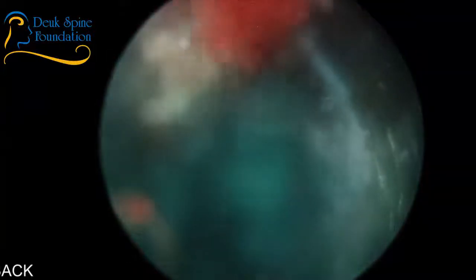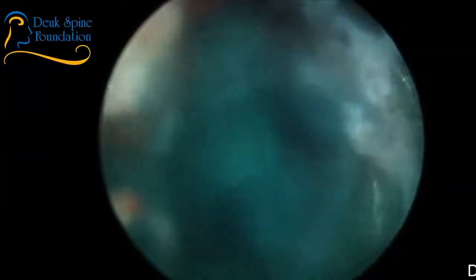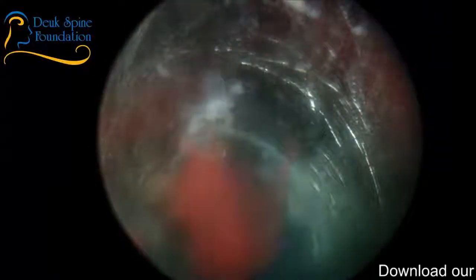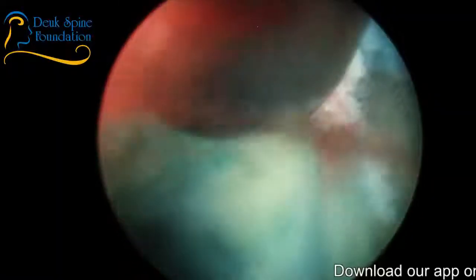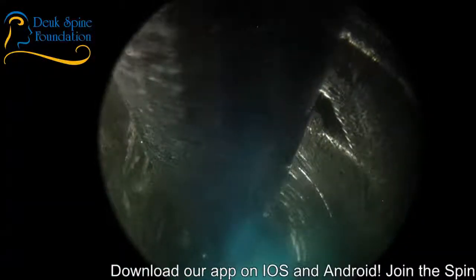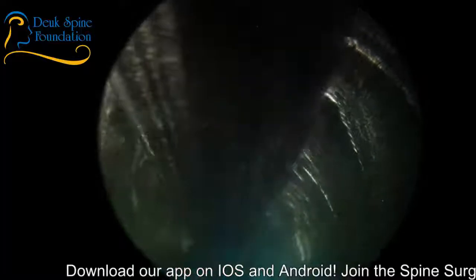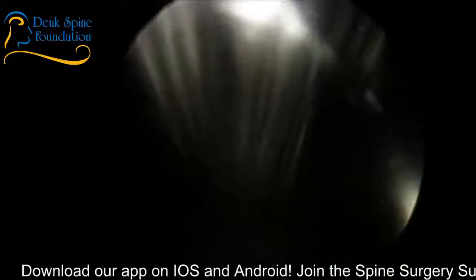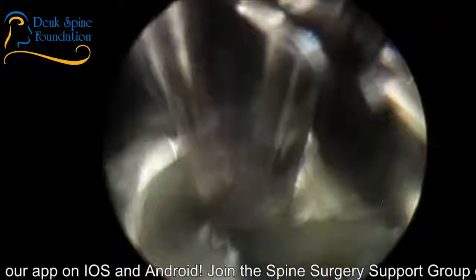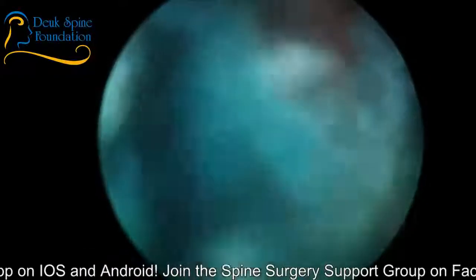We have a question. Yeah, so we're inside the disc. This is 3-4. This was the one that had 10 out of 10 back pain. So you can see it's not as old and degenerated or collapsed a disc. There's a piece of herniation right there I just took out. Give me a second, I'll get to your question. There's another piece of herniation right there. Yes, I'll take the question. Save those little pieces. I want to show our audience.